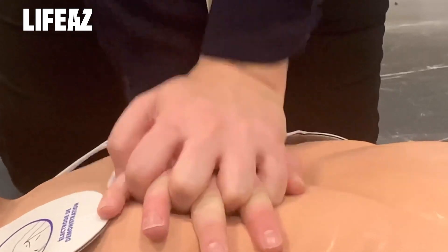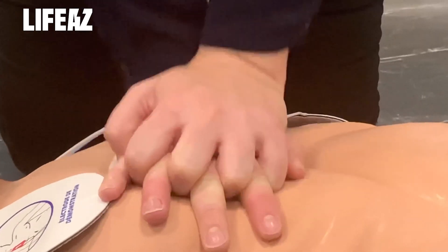For effective CPR, keep your arms perpendicular to the victim and lock your elbows in order to keep your arms straight.